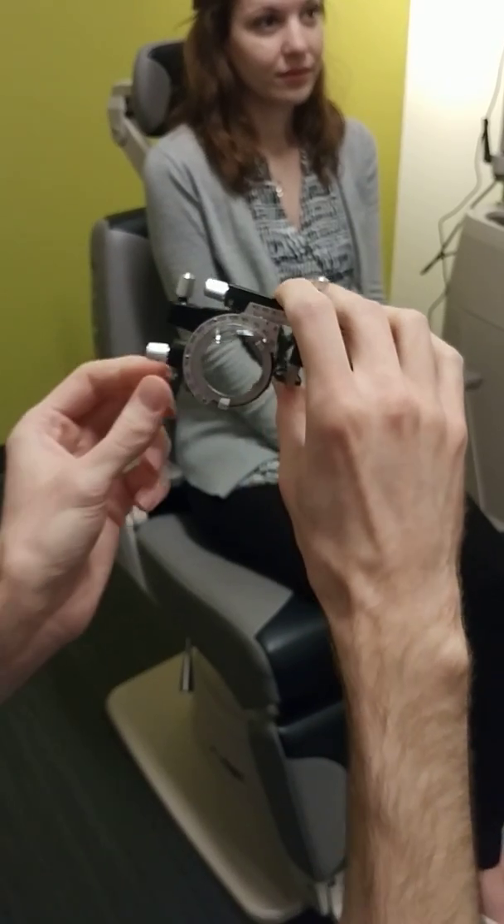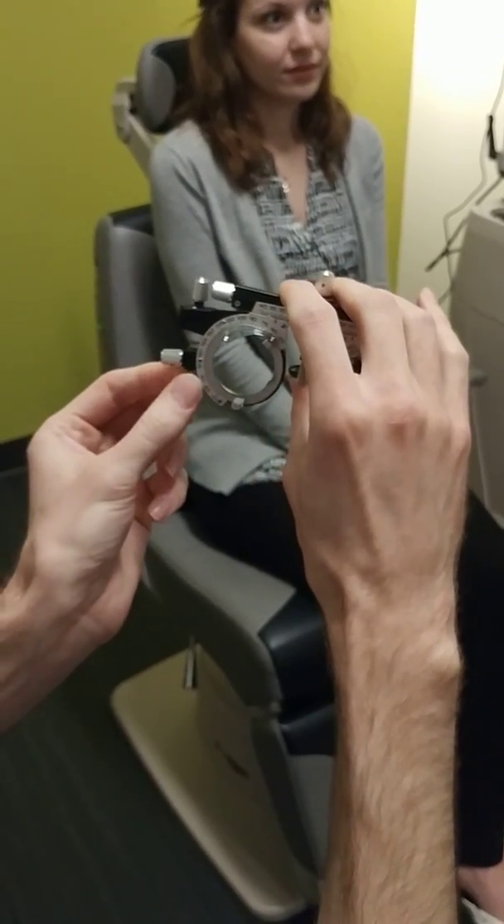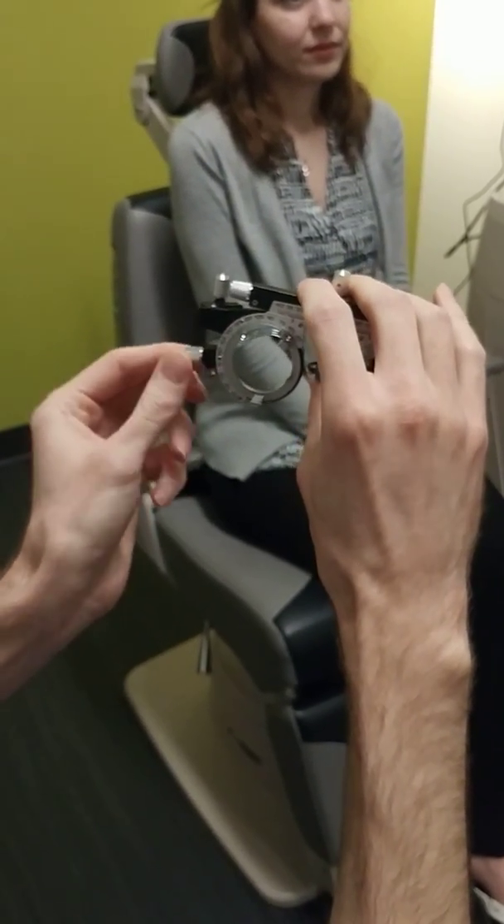The next one that's also pretty much never used is the axis lock down here.